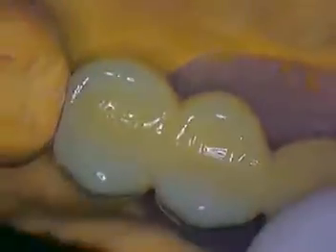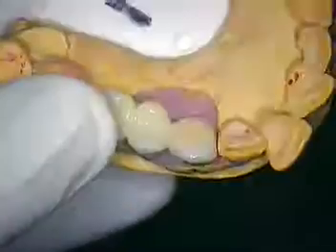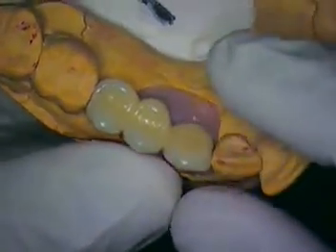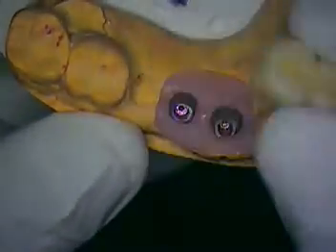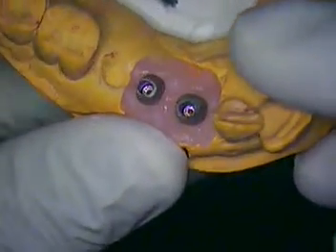Well, hi everyone. This is Dr. Jerry Cuomo in my private practice with my good patient here, Dr. Joel. He's going to get his three-tooth bridge today. Of course, we talked about the Strommen bone level implants and the advantages of this particular system when you can control the subgingival tissues. These are the two abutments that we'll be trying in and tightening down today.